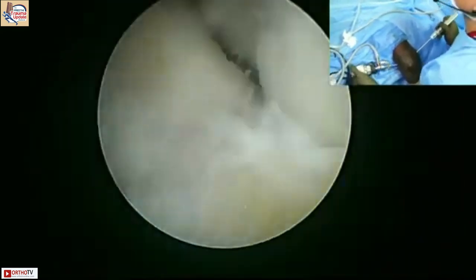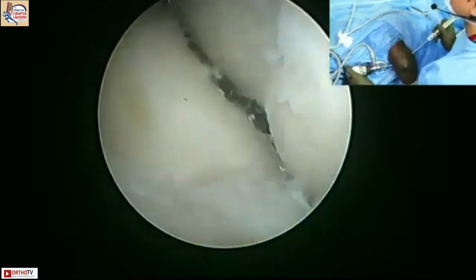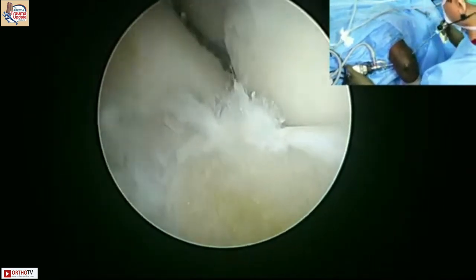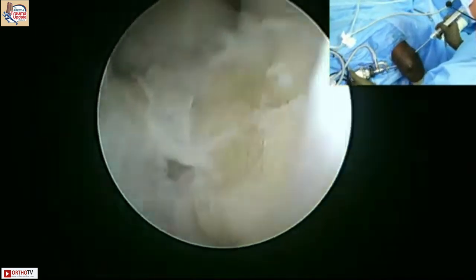Do we have cannulas for elbow, like shoulder? Yeah, you have cannulas, you have smooth cannulas. Okay. So don't use the cannulas that have got threads on. Okay. Towards you. That's it. David, drop it.